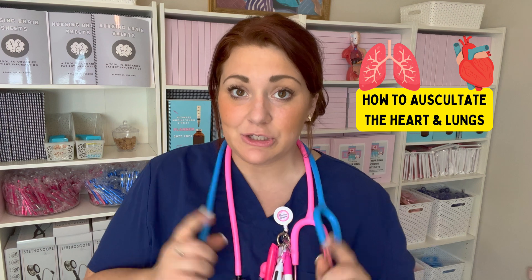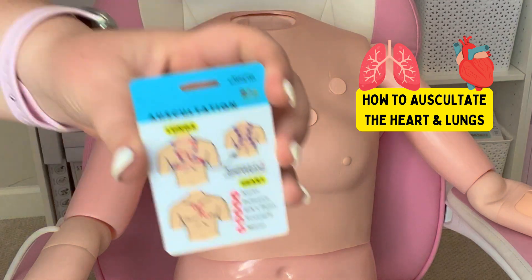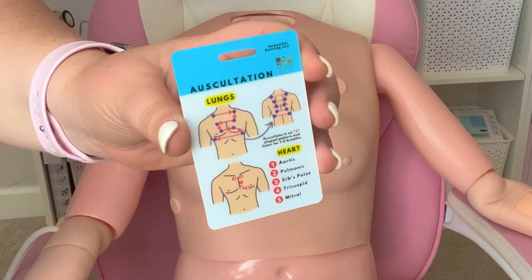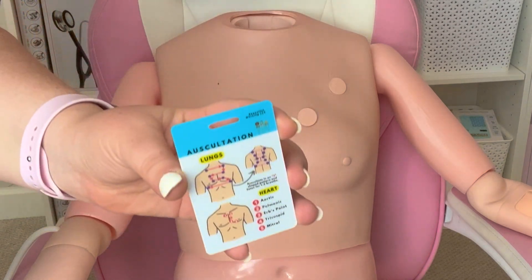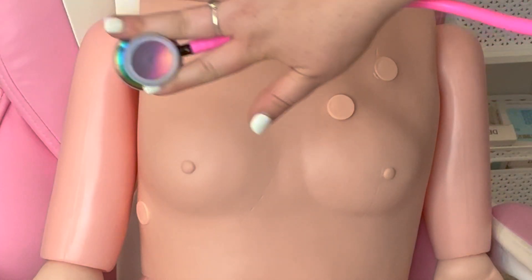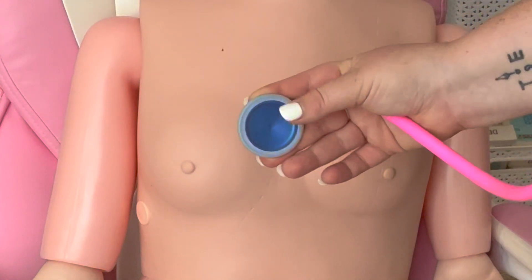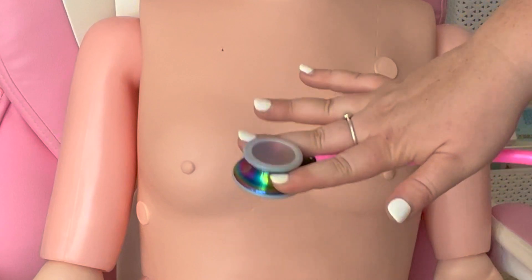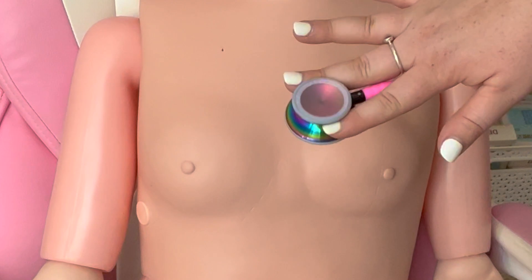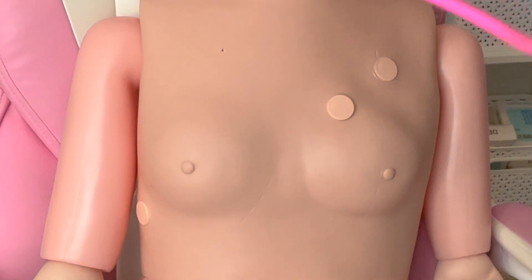I'll show you the proper way to auscultate. As you guys see in your nursing school kit, you also got this auscultation card. It shows you the proper way to auscultate the patient's heart and lungs, and I'm going to show you a demonstration here too. Make sure that you're holding it kind of between your fingers like this, so you don't have any fingers underneath that might disrupt any noises or have your fingers on the patient's skin, which might also affect the noise. You're just going to auscultate in an S pattern, kind of like Superman's shirt.